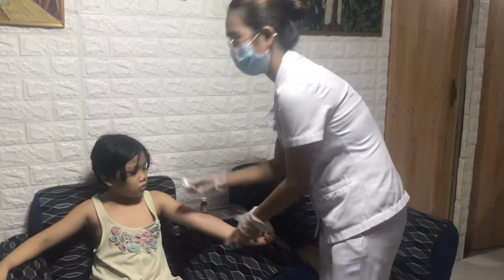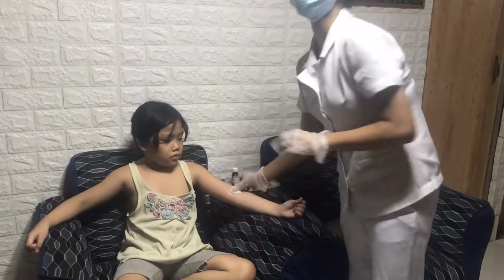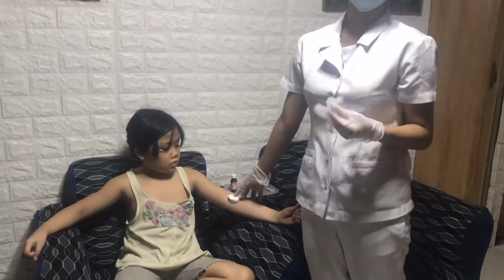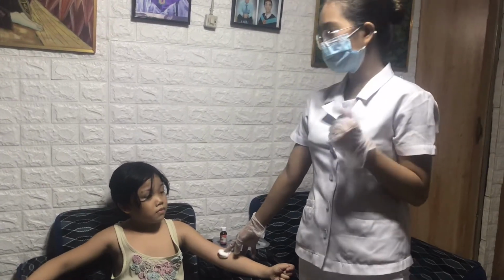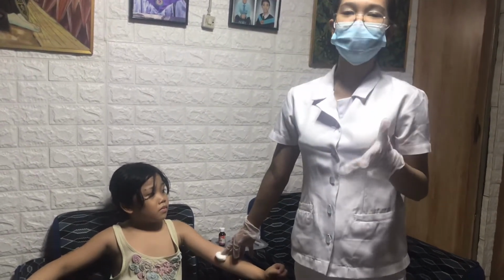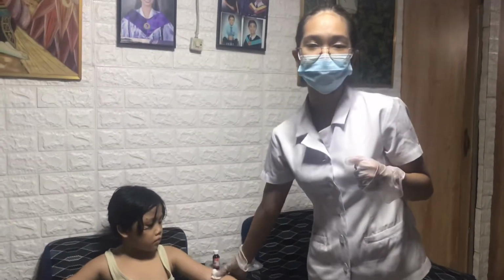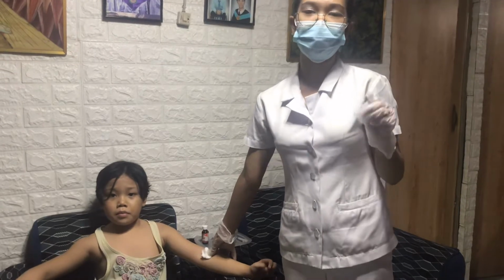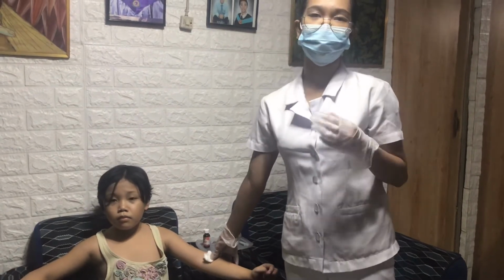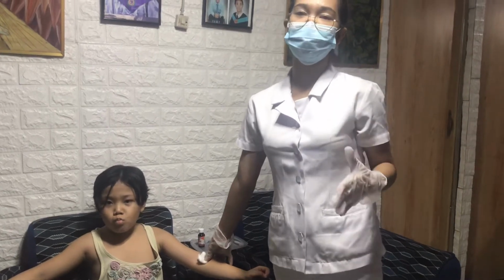So I'm applying the cotton ball and I did also encircle the wheel using the black pen. So next thing to do is to assist the patient to a comfortable position. Indicate at the back of the medicine card the site and the due time for reading. The rationale for this is that the nurse considers the well-being of the patient, and writing those data at the back of the ticket will serve as a reminder to the nurse that the procedure is done.